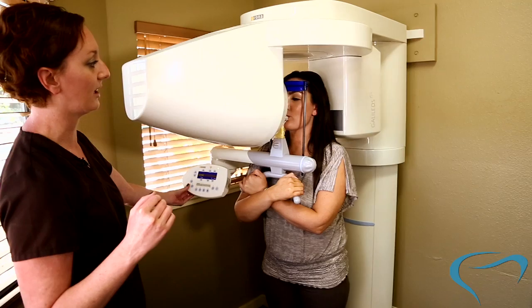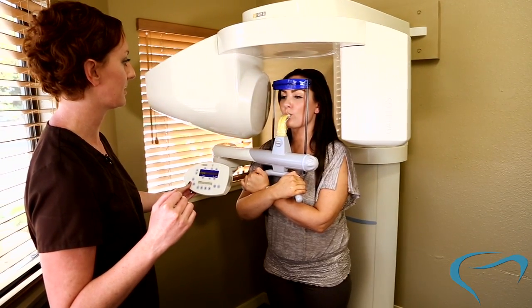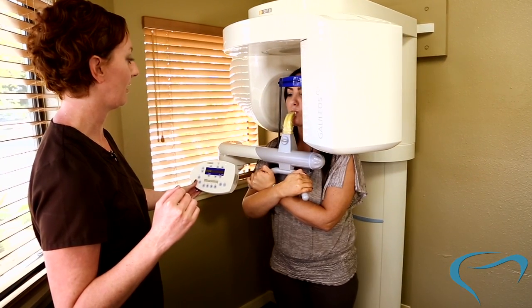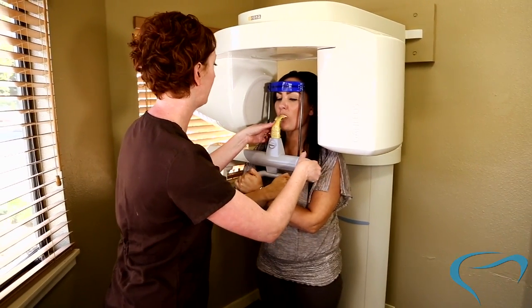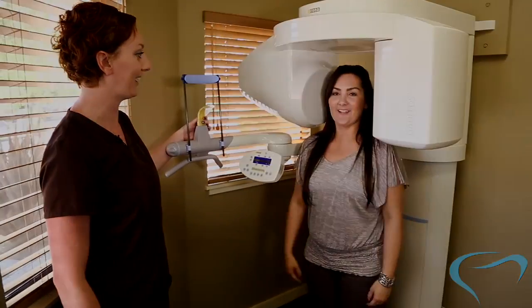Machine's about halfway done. Perfect. All right. Stay real still for a sec. And you can go ahead and open, and let go. And you're all done. Perfect. Okay, it's been easy.